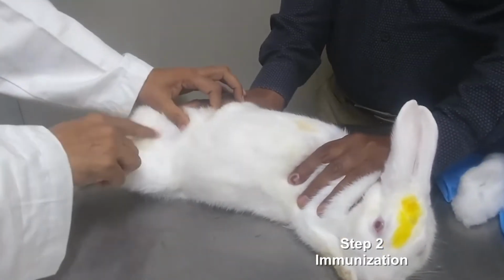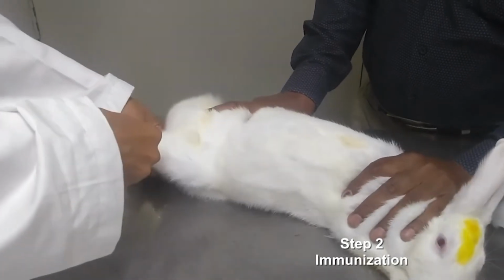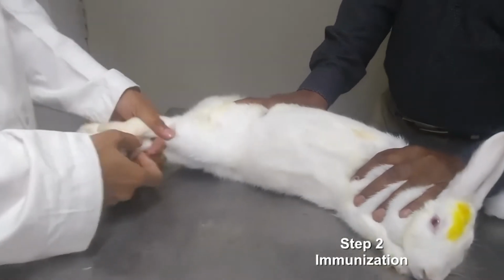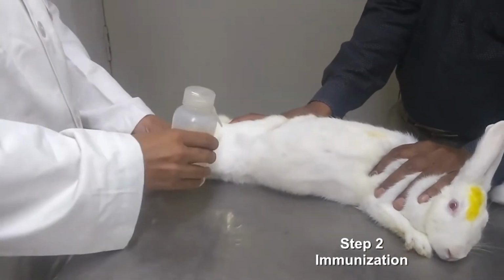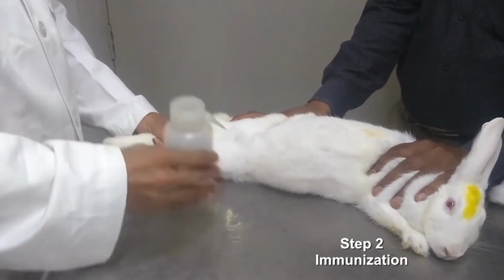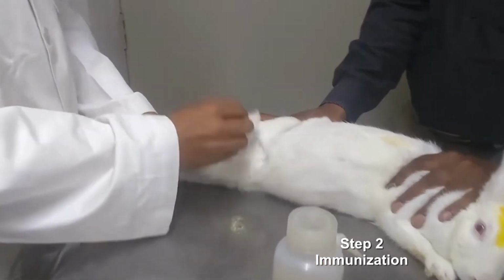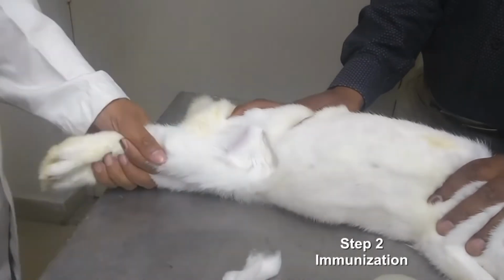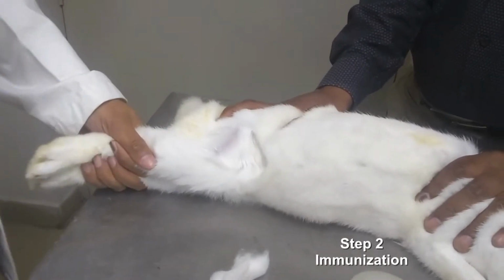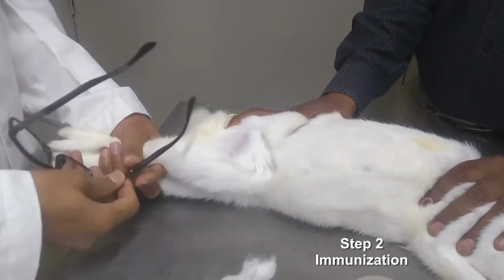We'll inject the emulsion into the thigh. So catch hold of both the legs, then we have to sterilize the area using alcohol. We have to look at the thigh muscles. They should be cleanly visible. Skin should be cleanly visible.